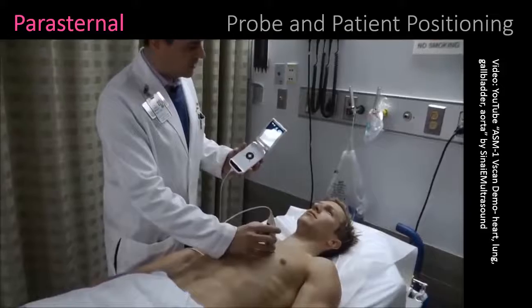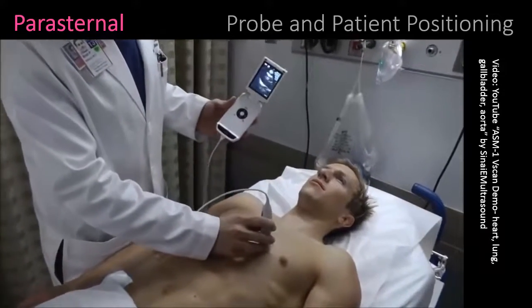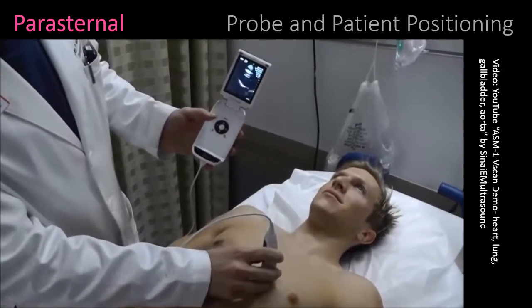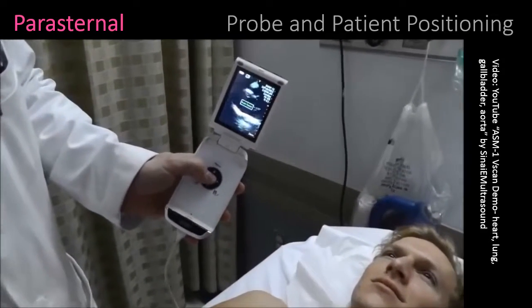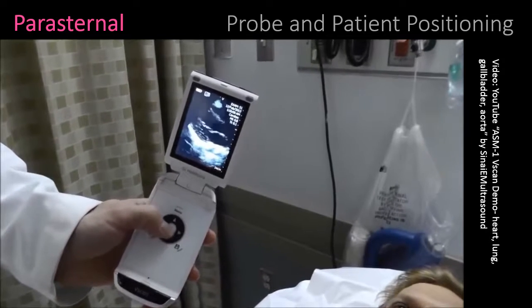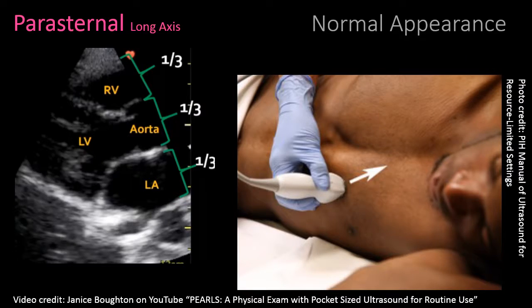So in the parasternal view, you want to place the probe in between the ribs. About the third or fourth intercostal space is a good place to start trying to see the heart here. And you're going to be just lateral to the sternum. And you may need to hug up fairly close to the sternum to be able to see without lung getting in the way. And you'll want to make sure that the probe marker is pointed towards the patient's right shoulder in this view.